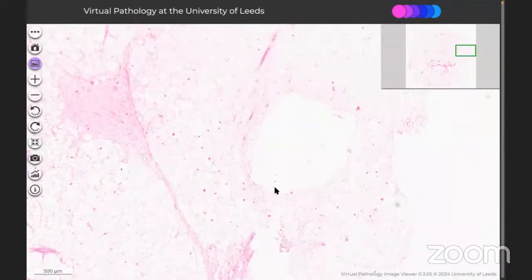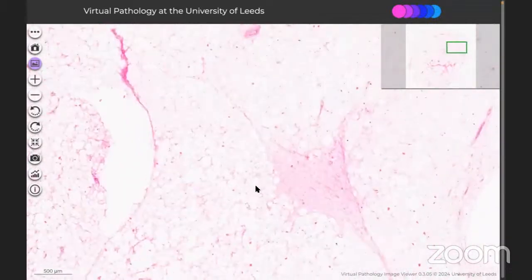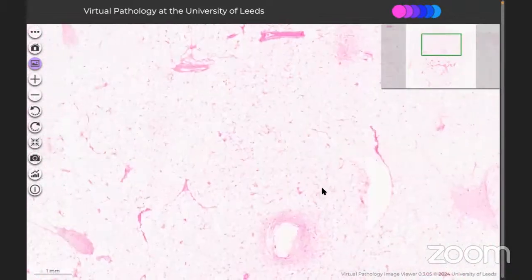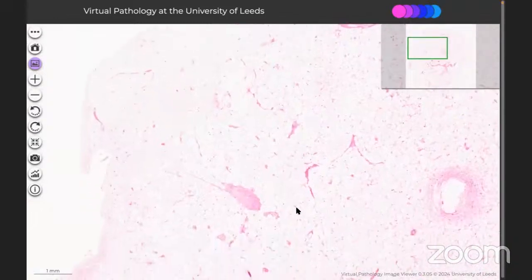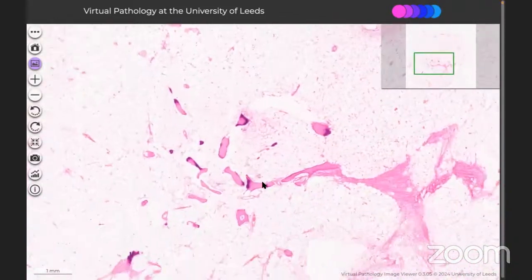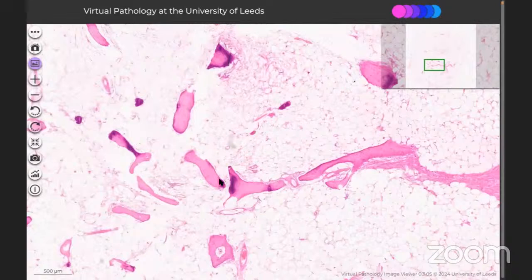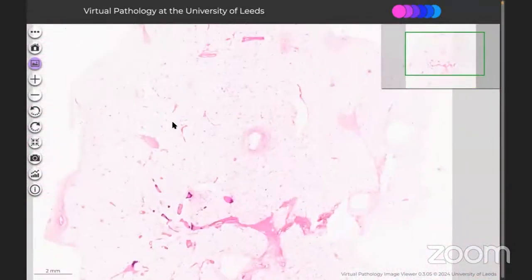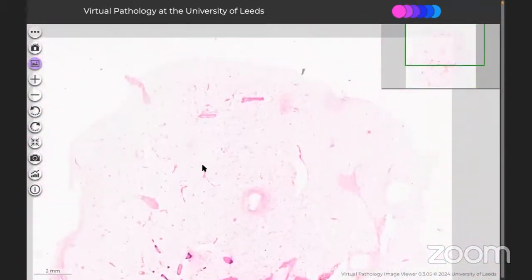You should also say that you will take other sections to look at the complete resection and the margin status, all that. And you say that this has some molecular alteration of chromosome 12, and that helps. And this is a part of bony metaplasia, bony metaplasia that is happening within the lesion. And obviously you should take sections to exclude a dedifferentiated liposarcoma, which is quite common in the retroperitoneum.